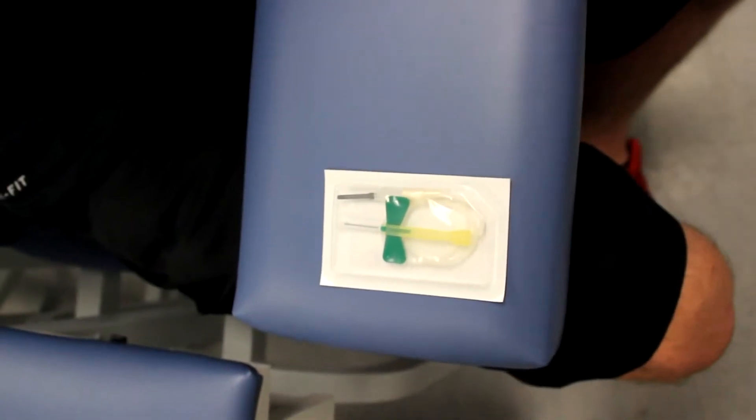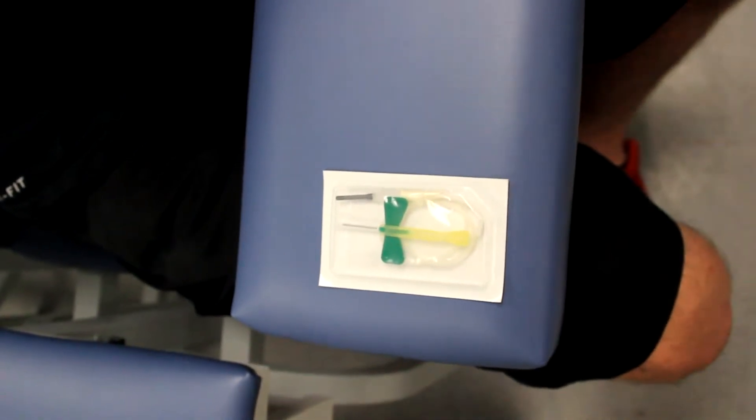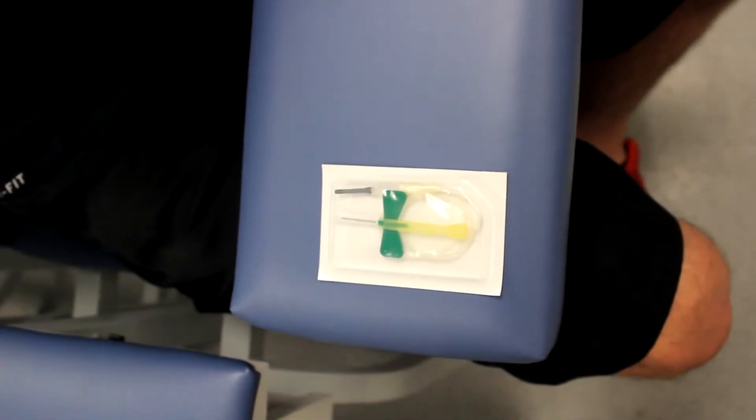The needle size generally used for phlebotomy is a 23 gauge by three-quarter inch needle. However, other sizes are available such as a 21 gauge needle pictured here.